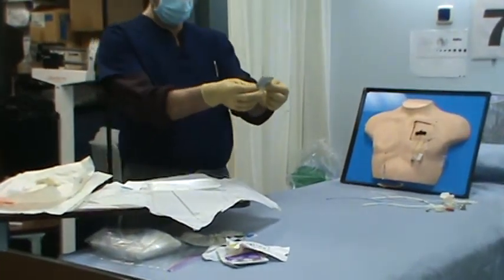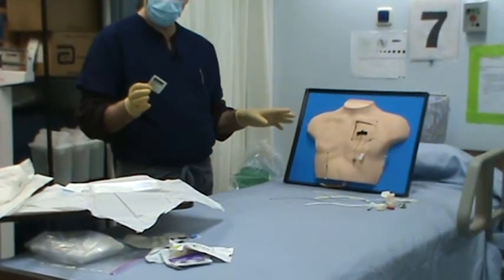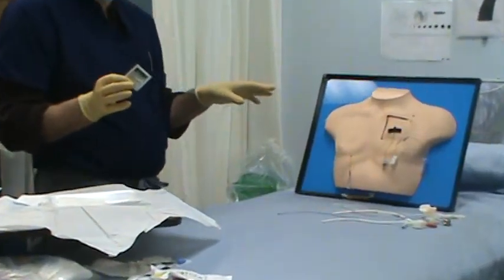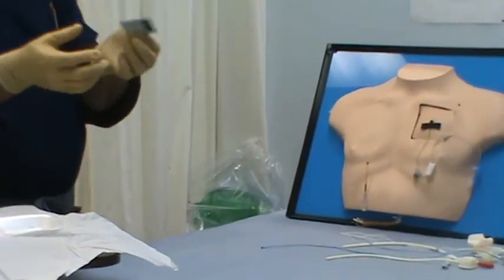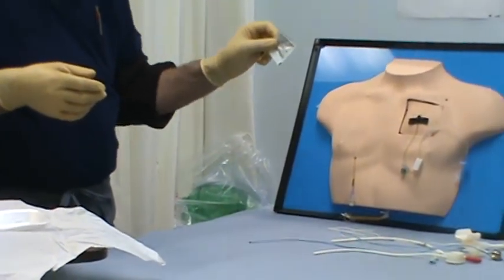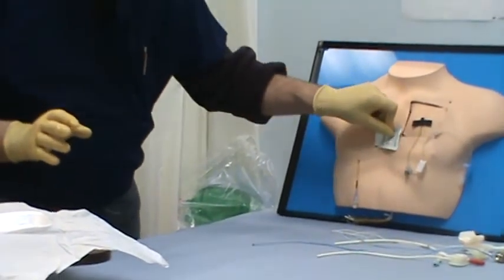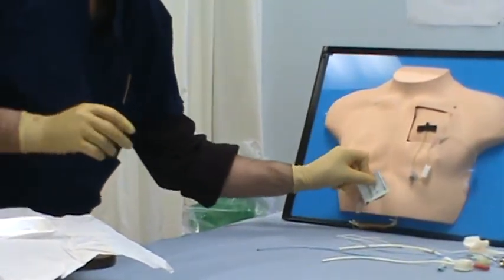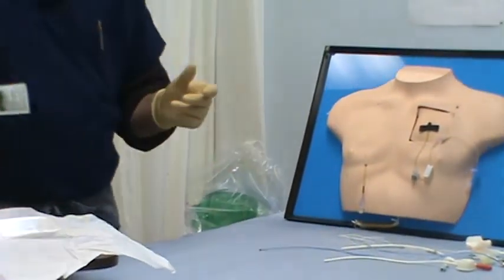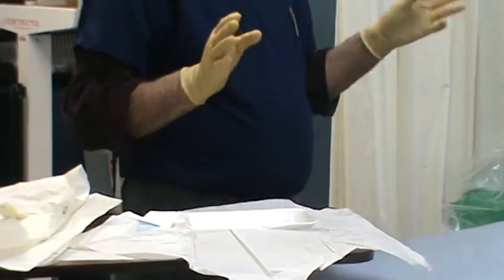Now this is a skin protectant prep pad. I got to give that a minute to dry. And you can see a wet sheen on the patient, and you can see when it's drying and going away. I'm going to rip this pad and just take it. And I don't want to get this on the insertion area, but I just want to go around it because this is what's going to prep the area for the tape. Because I'm going to tape this down. Okay, so that's done. That'll have to dry for a minute.